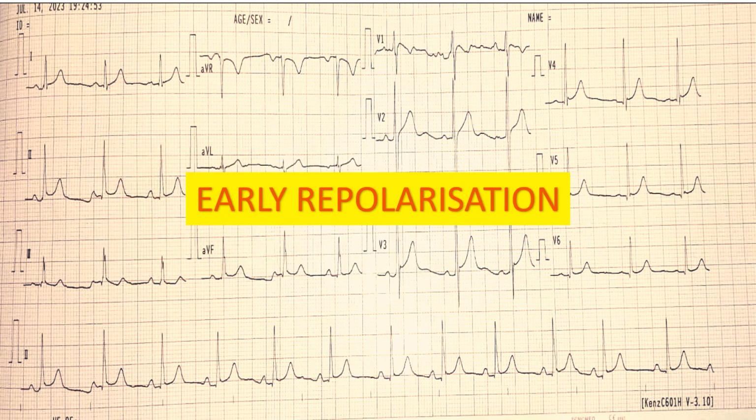So far we have managed to see that there are no specific appearance or ECG findings specific for myocardial infarction, and also there are no proper features on the ECG to suggest pericarditis. So this was a case of early repolarization.